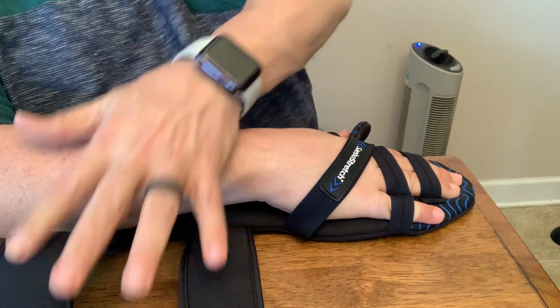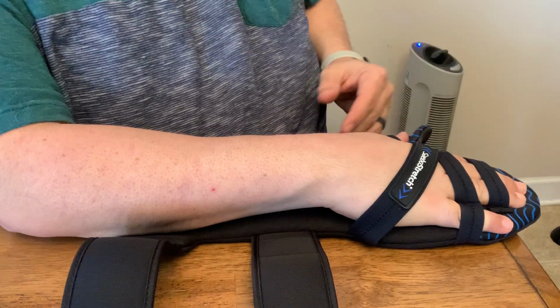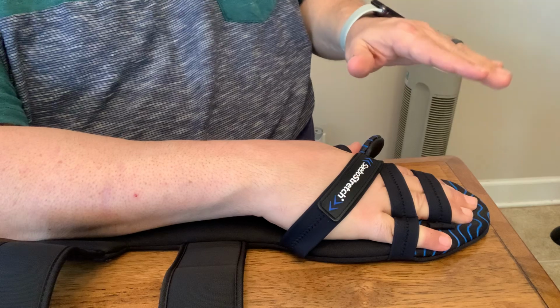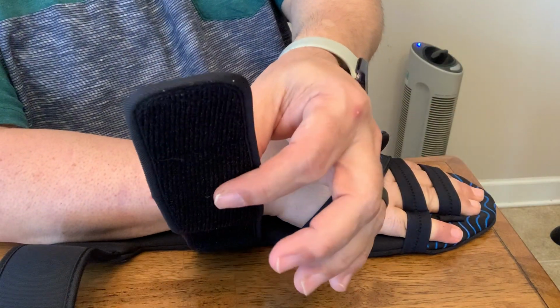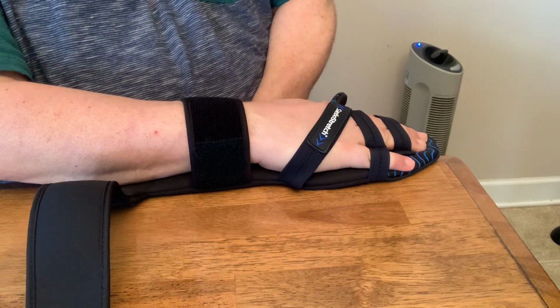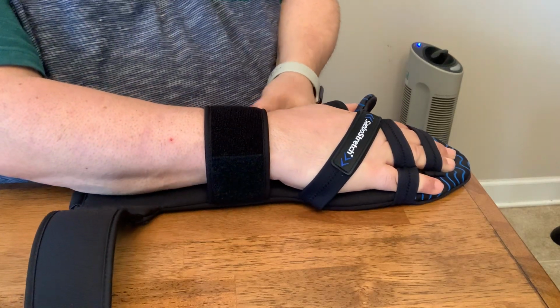The last step is these two big arm straps, okay? So if you look, my hand is good. I can go off to the edge of the table. It bends just a little bit. It's always keeping my hand straight. Same rule. You take this over, slide to the edge of the table and tuck under. Use the edge of the table to keep your hand straight, okay? And then tuck it under.